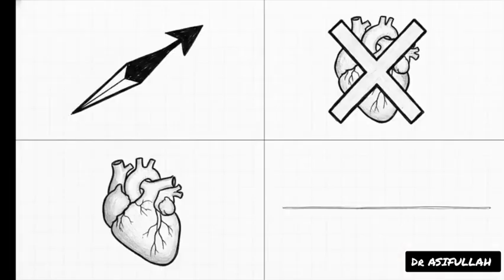To really lock this into your brain, we're going to use the LEFT mnemonic to quickly recall the criteria for a left anterior fascicular block. L is for left axis deviation. E reminds us to exclude other causes, which is absolutely critical, by the way. You have to check for mimicking deep Q waves from an inferior MI, or consider left ventricular hypertrophy, because that can independently alter the vector. F stands for front or anterior fascicle, and T reminds us that it is thin with a single blood supply, making it highly vulnerable.